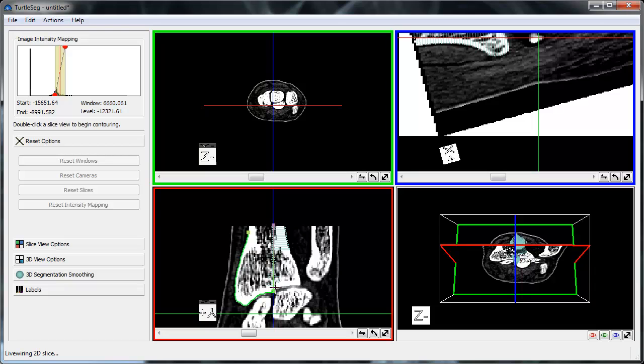While contouring this slice, the purple line segment that represents the previously added contour turns green on one end as we move the mouse over it. The green indicates that by left-clicking to place a seed point here, we would link our contour in construction with the previous contour, ensuring that they are consistent with each other.